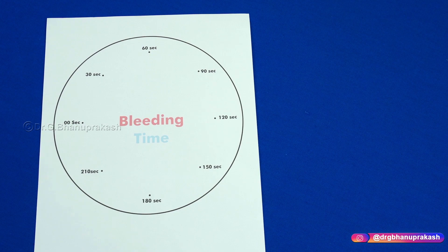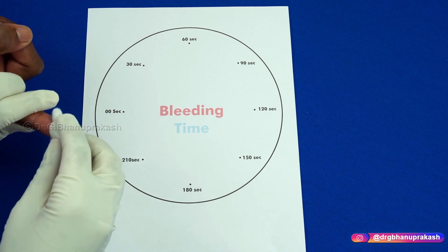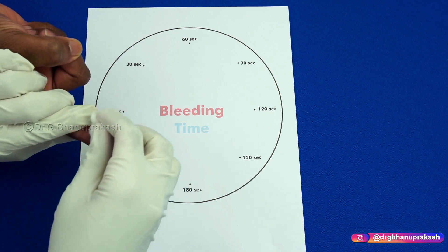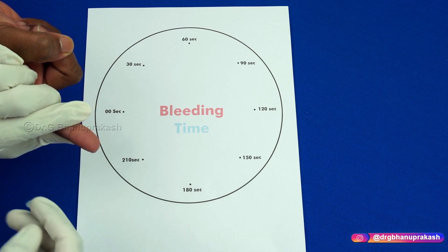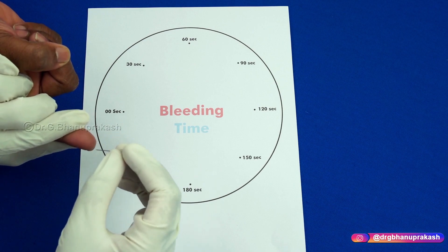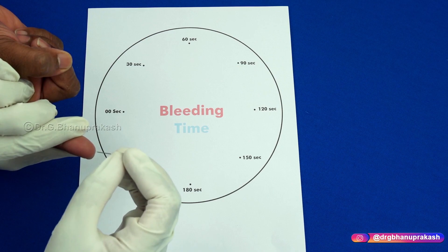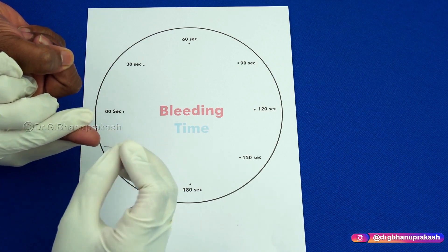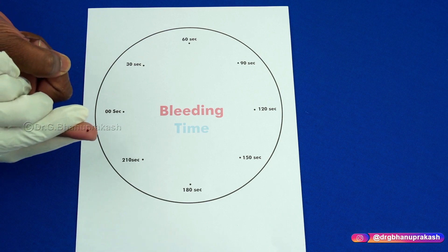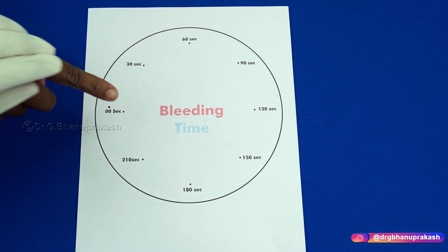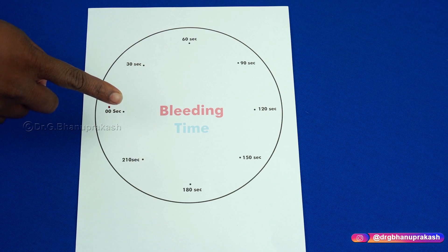Now let us start the procedure. After explaining the procedure to the patient, take the patient's finger and completely clean this area from center to periphery — sterilize for about 30 seconds. Now take the short needle and prick the patient's finger. The moment you see blood coming out of the finger, start the timer. The patient places his first drop of blood at zero seconds.